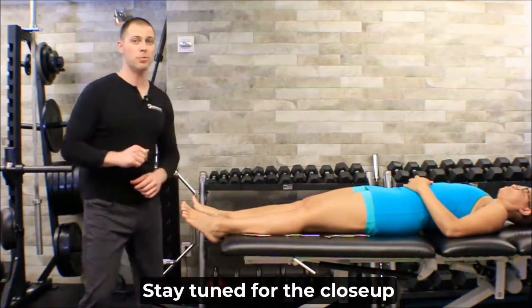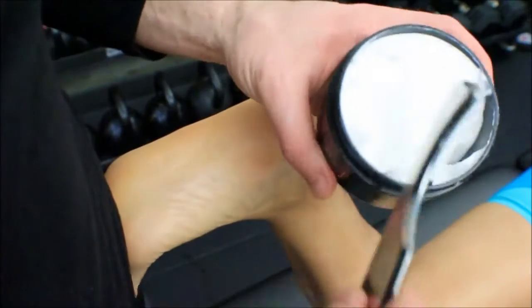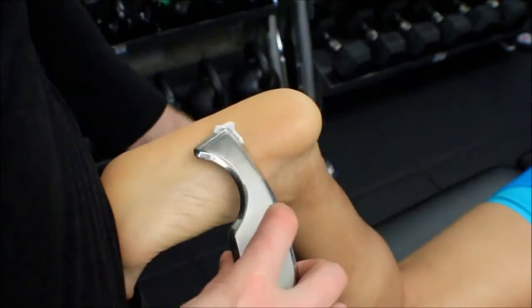Stay tuned for the close-up recap. All right guys, for your close-up recap, I'm going to use just a little bit of cream here on the bottom of the foot.